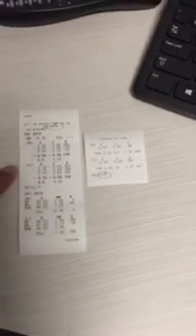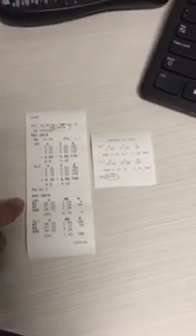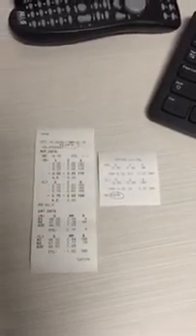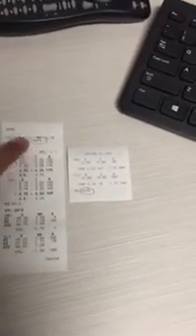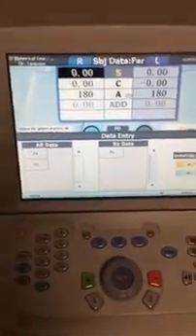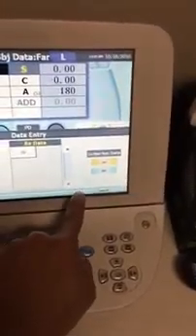So this is the auto-refractive data with the Ks. This is lensometry, so you're looking at 74 and 76. So when we go up to this machine here, the central unit, we see 74 and 76 corresponds to this particular patient, and we are going to hit OK.